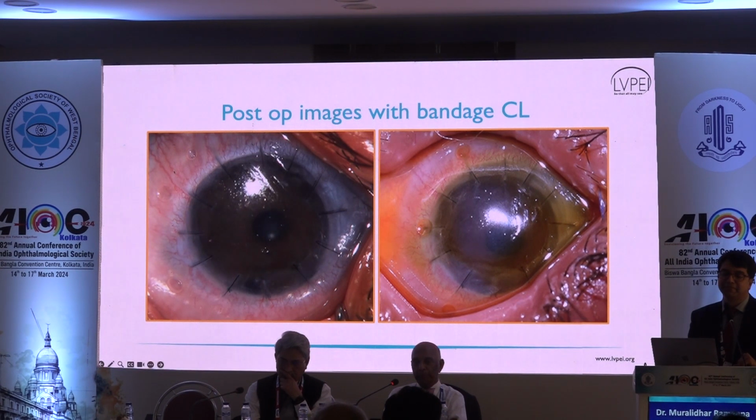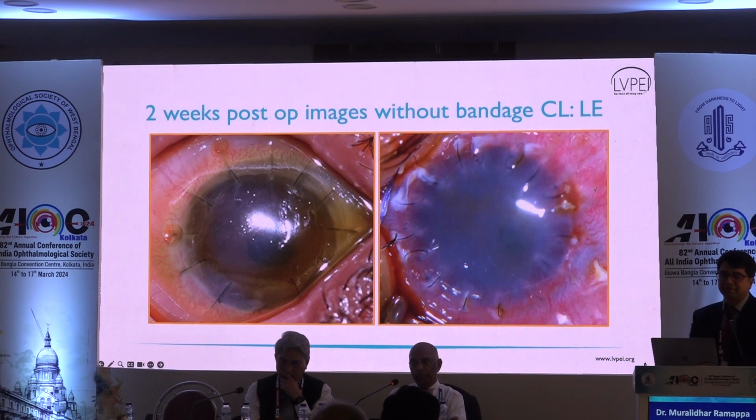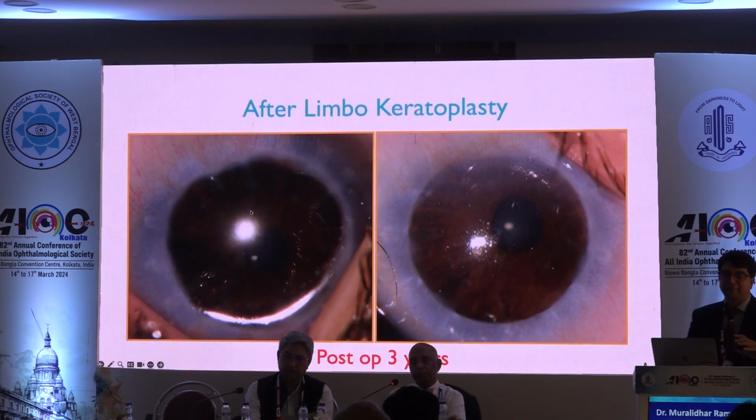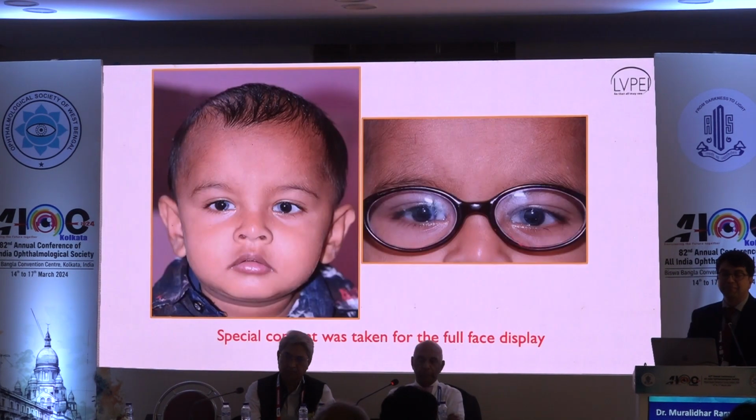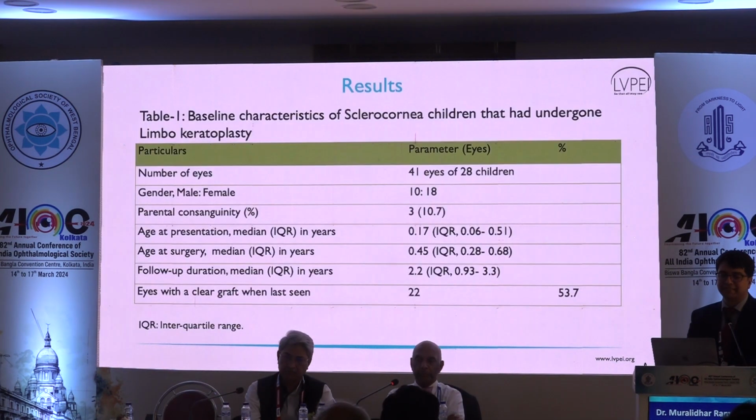Post-operatively, I also supplement them with a specialized contact lens. In one case the child had lost the contact lens. You can see a florid inflammation with all the loosened sutures. Meaning, this contact lens, similar to the keratoplasty, if we continue for a long time until all sutures are out, it minimizes the surface inflammation and also prevents irreversible rejection. This particular child is doing extremely well with this 5 to 6 millimeter graft, and there are numerous such examples.